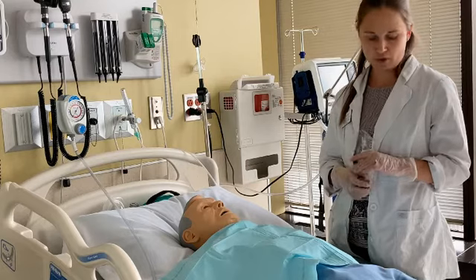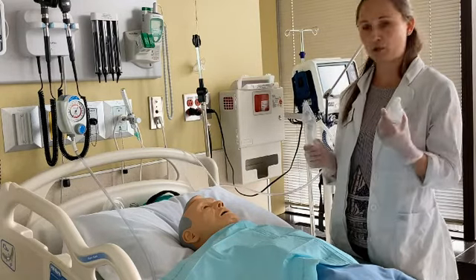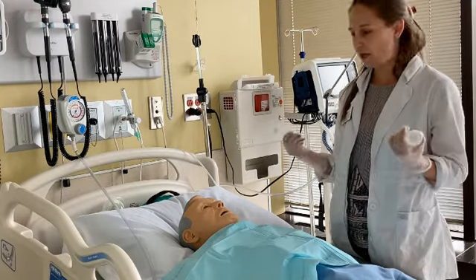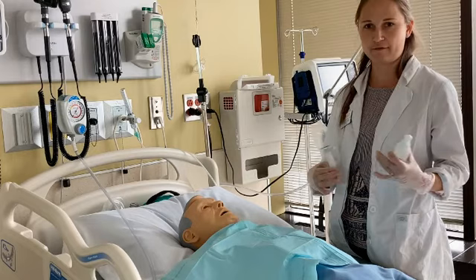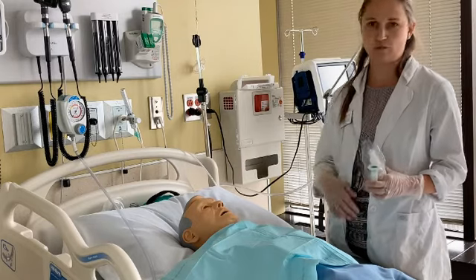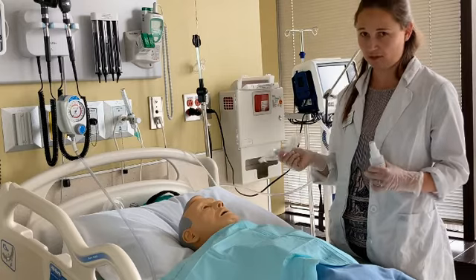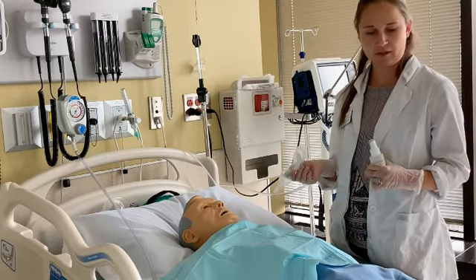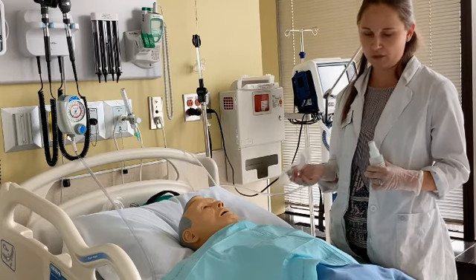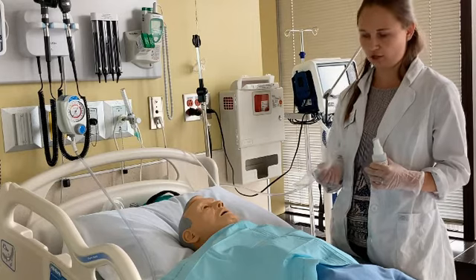So to do this procedure, I will need my oropharyngeal airway, I will need a water-soluble lubricant, and my patient. So again, I have assessed my patient, I have identified my patient, and went through ABCDs to make sure that this patient actually requires this airway. And then I have chosen the correct type, because in theory, I have two choices for this patient. I could put in a nasopharyngeal airway or an oropharyngeal airway.